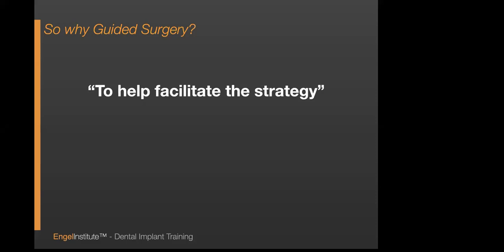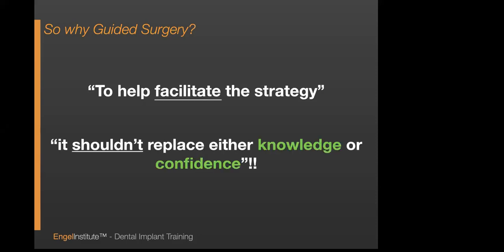It's there to help you facilitate the strategy that you already know how to do. In other words, if you were going to hop on a bus to go downtown, you know how to go downtown. You've just chosen to take the bus instead of the car. So this is to help facilitate it. This shouldn't ever, ever replace either knowledge or confidence.